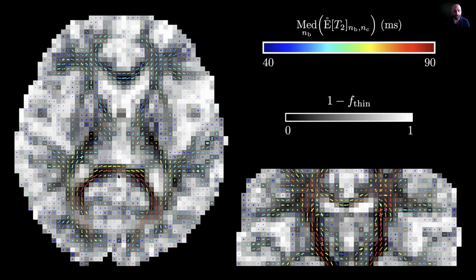And here you have also a part of the posterior, the back of the corpus callosum, that is called the forceps major, because it's bigger than the forceps minor that is in front here. And this also has a very bright red T2. So it seems like it has a higher T2.